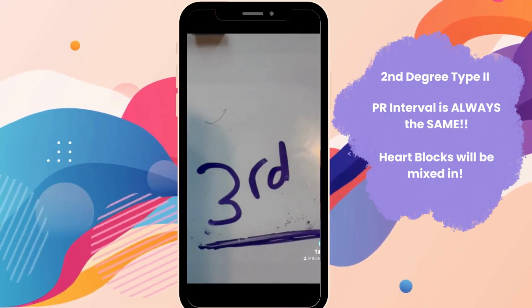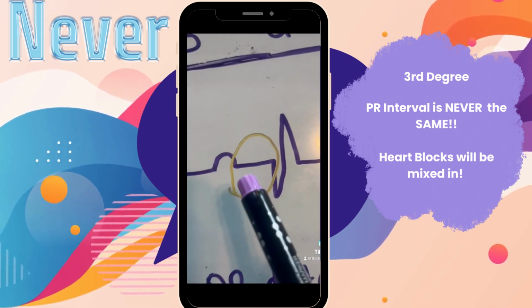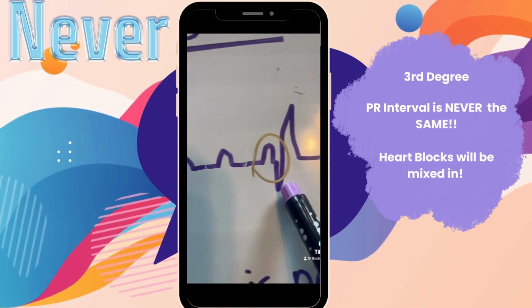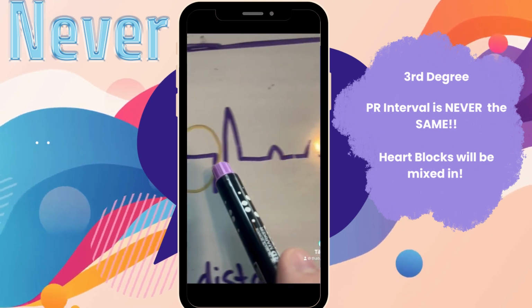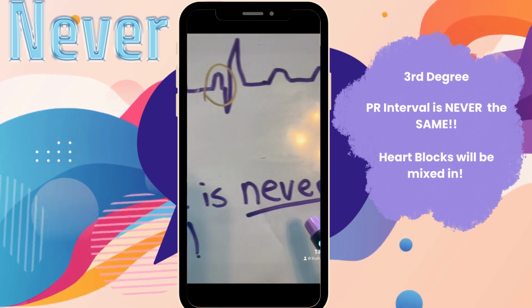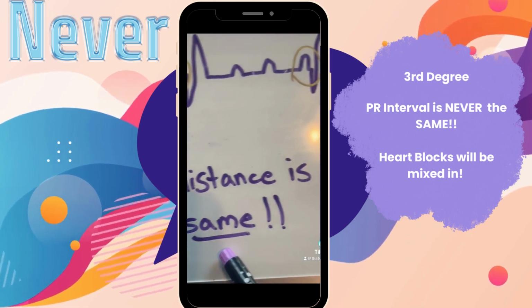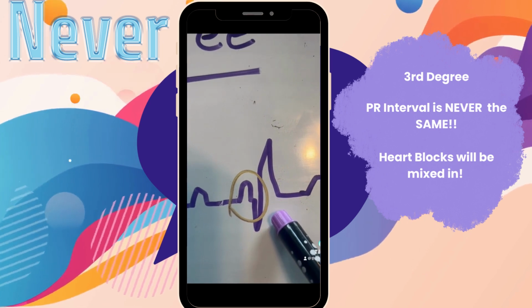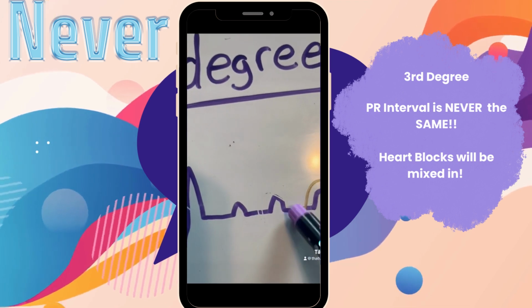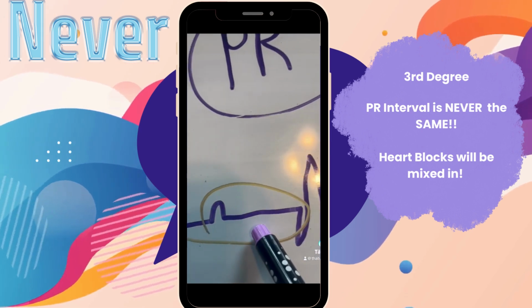Now moving on to the last heart block to remember, it is the third degree, and once again, we only look at the PR interval, because in third degree, you're seeing there's heart blocks in there, but in the third degree, the PR intervals are never the same. So when we think about second degree type 2 versus third degree, we know that third degree is never the same versus second degree type 2 always has the same PR interval. So going back, you see that the PR interval is super narrow here. There's heart blocks in between, but look at the PR interval here. It's completely different.